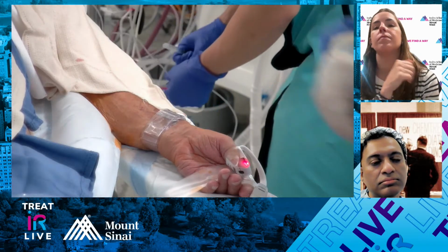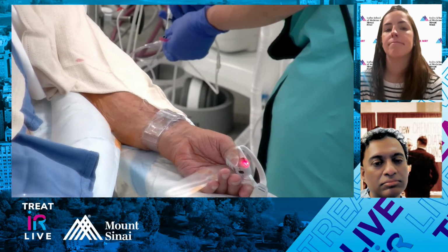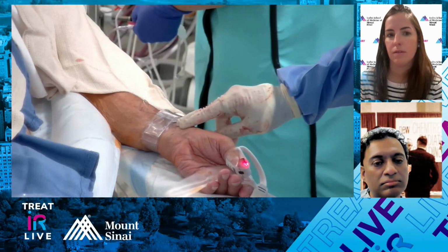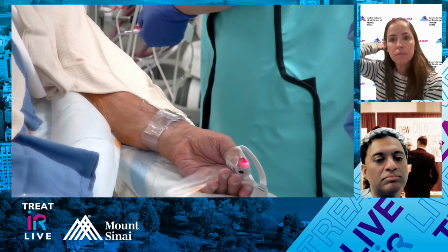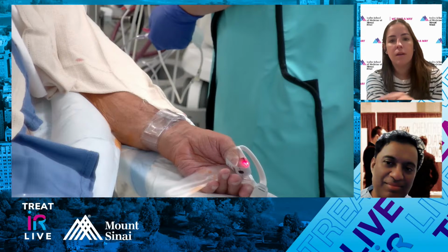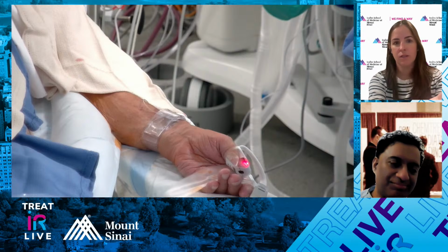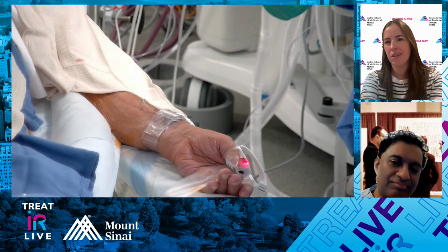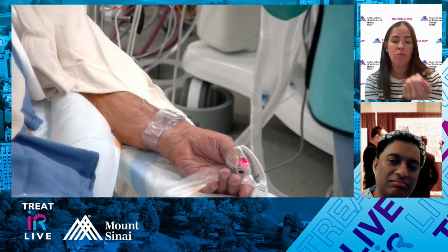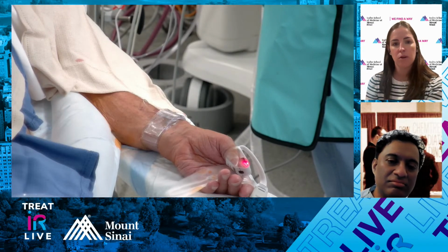The other thing we do is we monitor the perfusion of his hand. So we keep our own pulse ox on his left thumb. And there's a good waveform, so we know his hand is well perfused. We do feel a pulse distally, so I'm not really worried about his hand perfusion. So that's how we monitor our access. Important point: that's patent hemostasis. So there's two ways that he's monitoring. Sometimes you can't feel the pulse exactly because maybe you accessed a little too low and your TR band is over the wrist or distal forearm, but you can always put on the O2 sat monitor. And if you have a good waveform, it's perfusing.